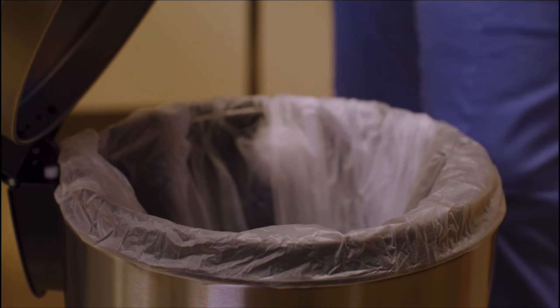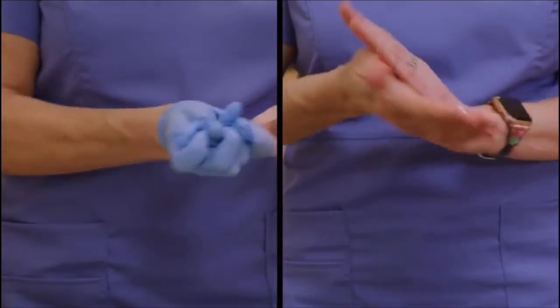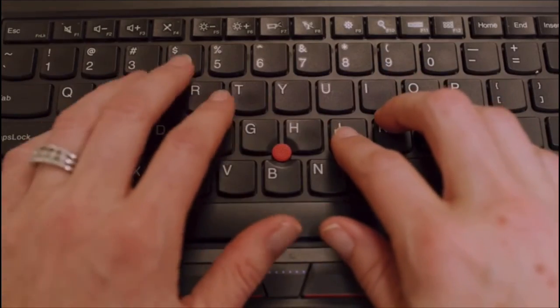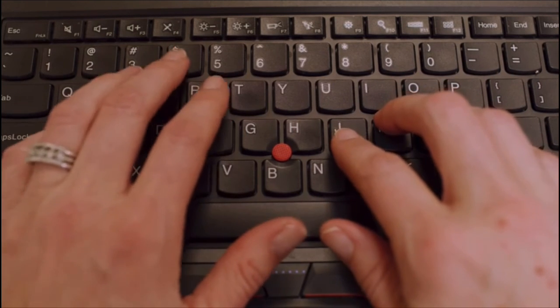Dispose of the waste in a trash can, clean and disinfect the area, remove your gloves, and perform hand hygiene. Document the procedure in the patient's medical record. Include the date and time of the irrigation, the ear you irrigated, the solution, including the strength and the volume used, observations of the irrigated fluids, and the patient's tolerance to the procedure. Document any teaching instructions as well.